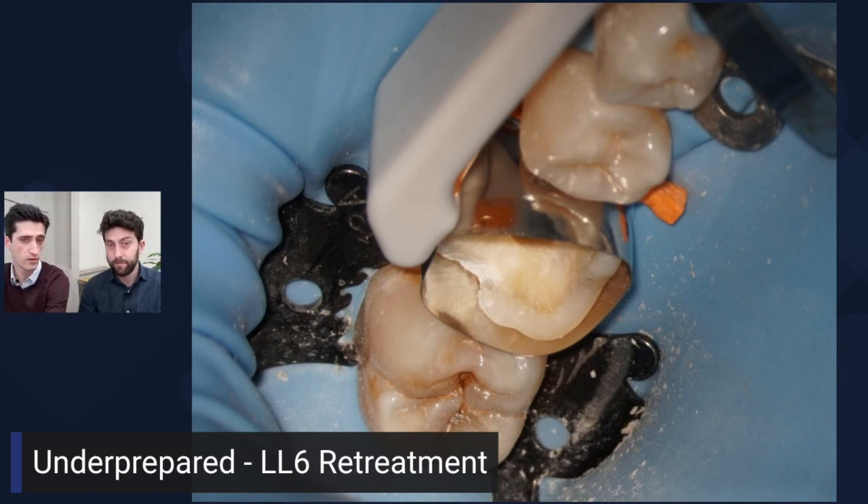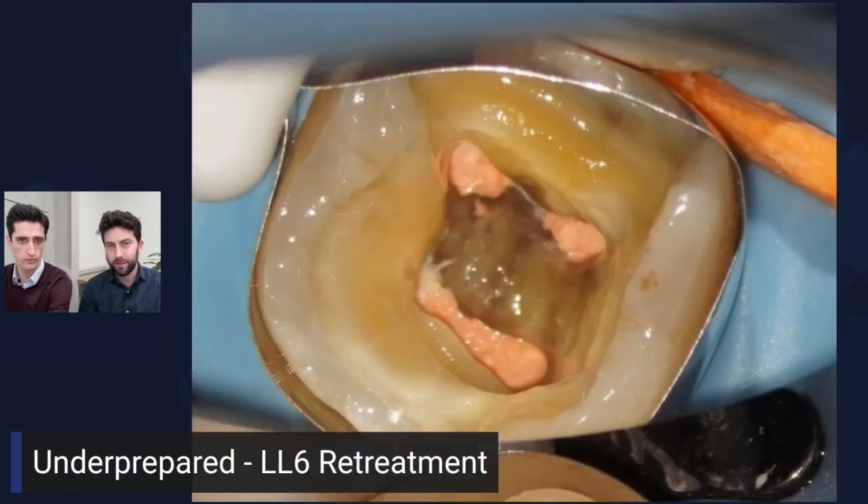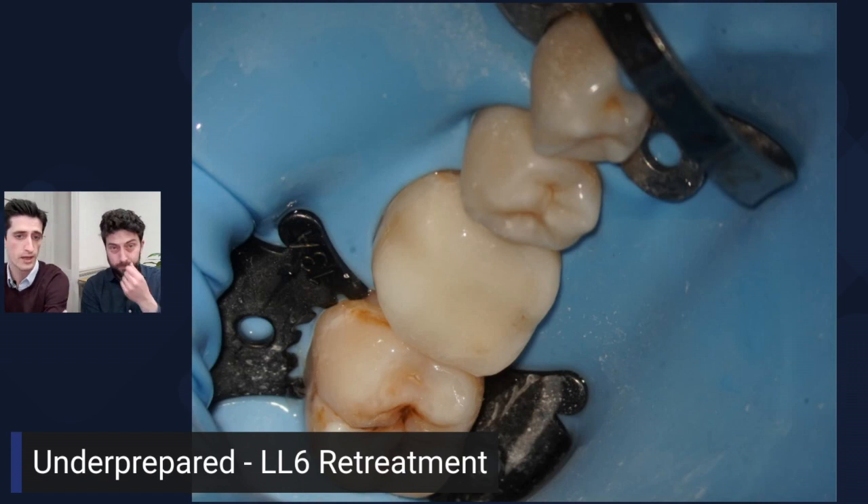A standard ProMatrix sectional matrix goes in between the teeth — nothing too fancy. For the tooth itself, we've cut the GP just below the orifice level — nice and clean. We tend to etch and bond, and we clean the cavities with alcohol because we use an epoxy resin-based sealer, so we just want it looking really clean. If you take a photo every time, you look at the screen and can see if it's not clean. This is critical for coronal seal — you can't bond to GP and you won't bond to sealer smeared all over the pulp floor.